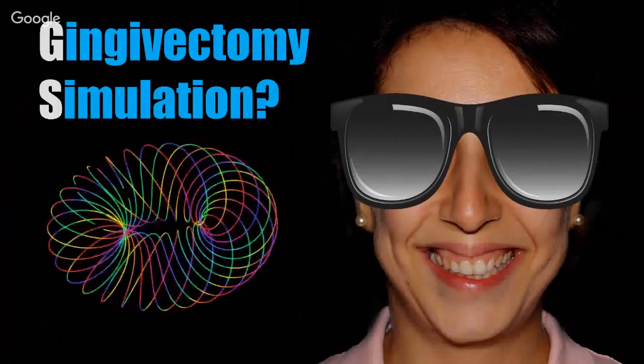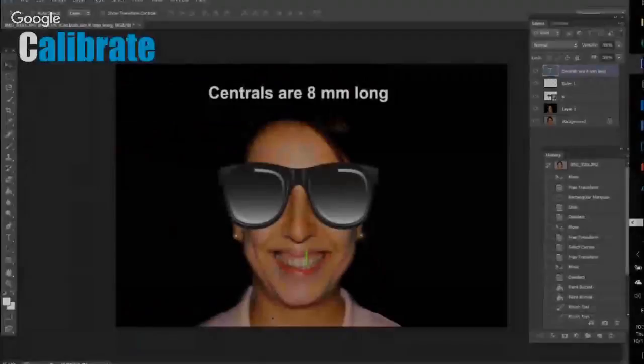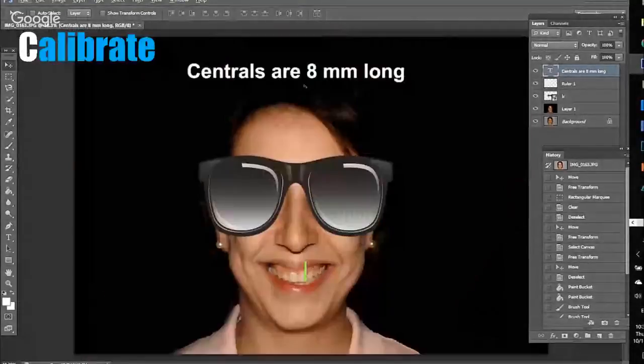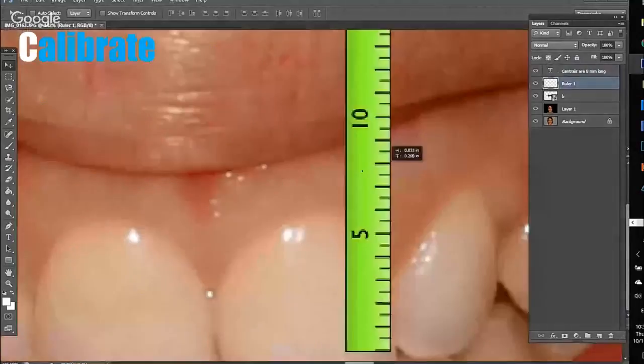Now, the second clinical case is that of a gingivectomy. You want to simulate a gingivectomy. How are you going to do that with regular digital smile design?